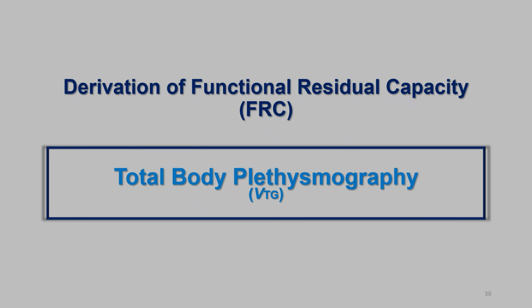That being said, airway resistance VTG should not be used to determine static lung volumes. Additionally, since the VC should be linked to the FRC measurement, performing a vital capacity during airway resistance measurements may cause an alteration of the resting airway resistance through relaxation or constriction of the airway smooth muscle.